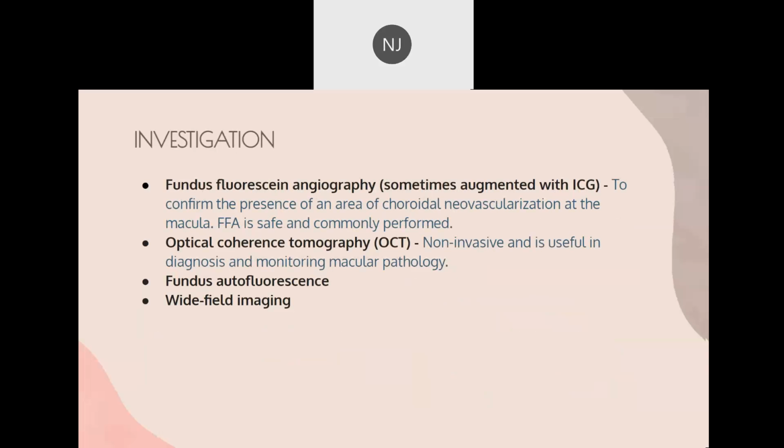As for investigation, sorry for the slide. The investigation includes wide field imaging in the form of fundus fluorescein angiography, which is sometimes augmented with ICG. This is to confirm the presence of an area of choroidal neovascularization at the macula, and this uses the dye.